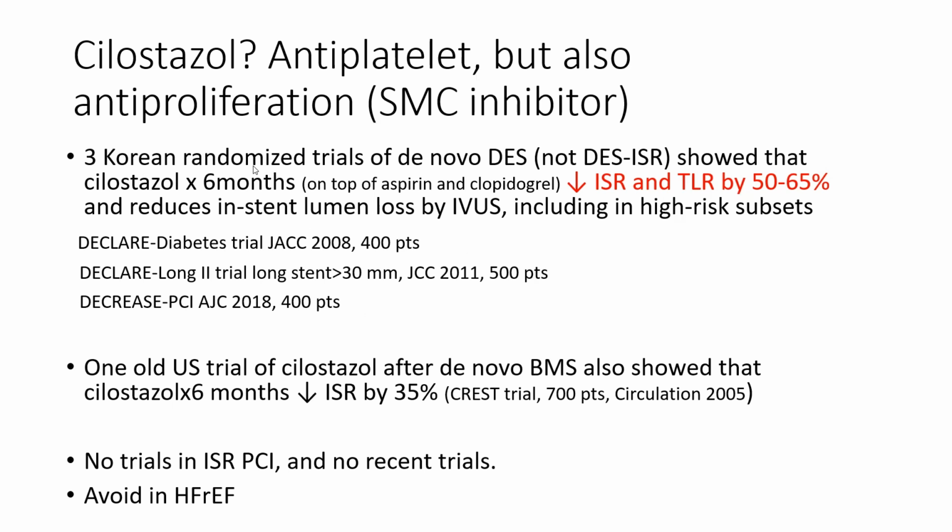There are 3 Korean randomized trials published in major journals that used cilostazol after de novo DES placement, not DES in-stent restenosis. But with that, they showed a dramatic reduction of in-stent restenosis of 50 to 65% among diabetic and long lesions. There are 3 trials published in good journals. Problem, they were de novo DES.